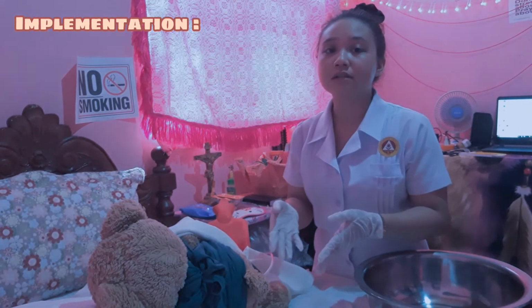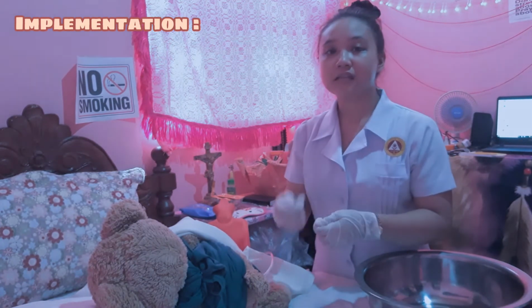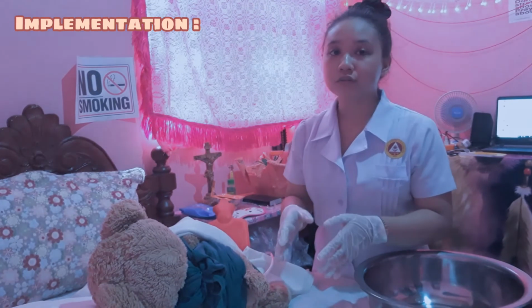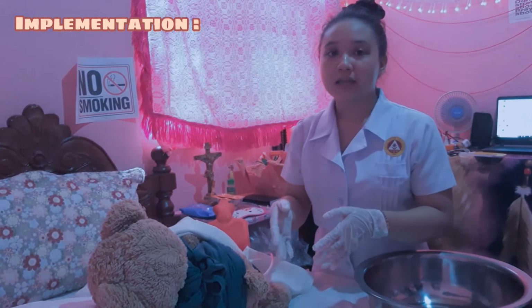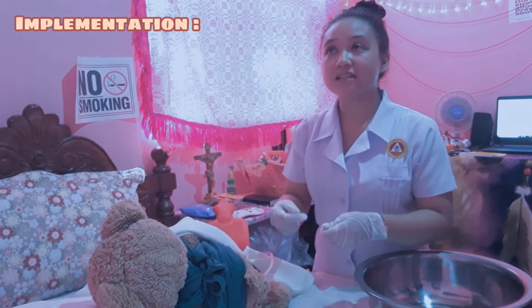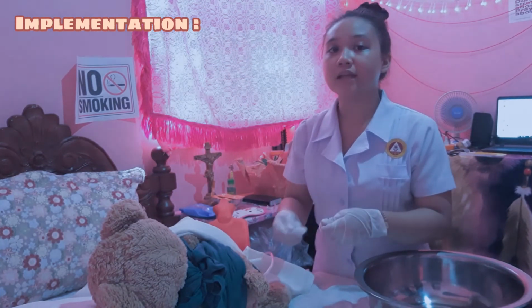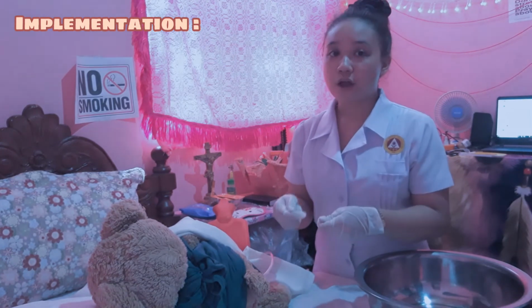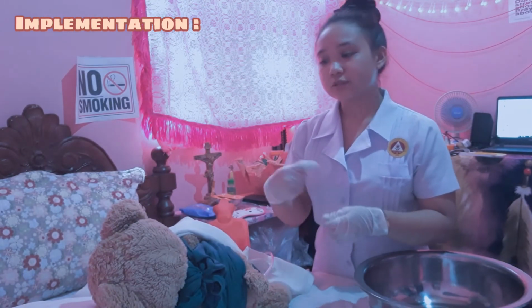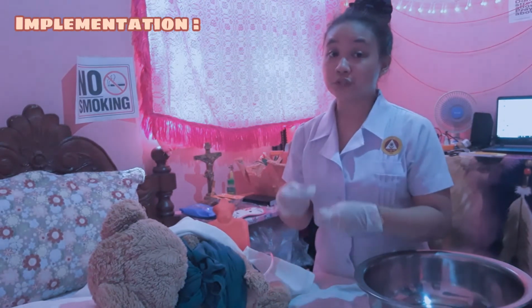After all the solution has been instilled, or when the client cannot hold anymore and feels the desire to defecate, close the clamp and then remove the rectal tube from the anus. Place the rectal tube in a disposable towel as you withdraw it.